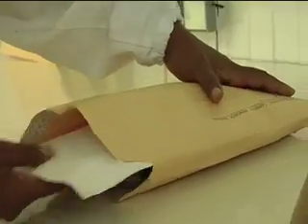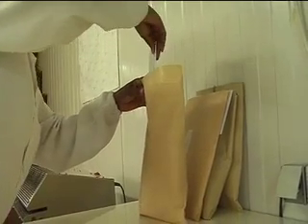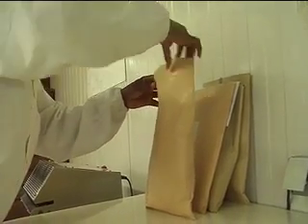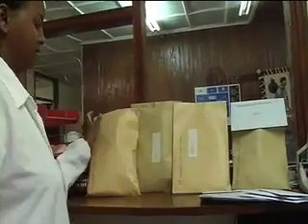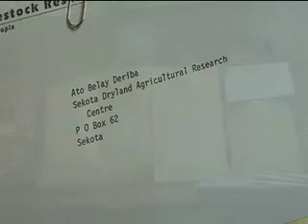Seeds that are being sent outside the country will need to be sent for quarantine inspection before shipping. All packages should be finally checked against the list and packed into larger envelopes for shipping. When requests are to be collected in person, the seed samples in the small envelopes should be placed into larger envelopes with the request papers inside, writing the name and address of the requester on the outside.